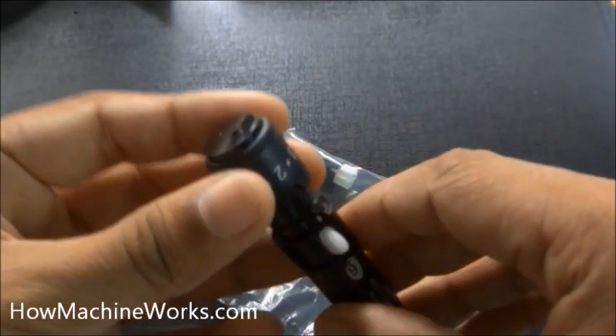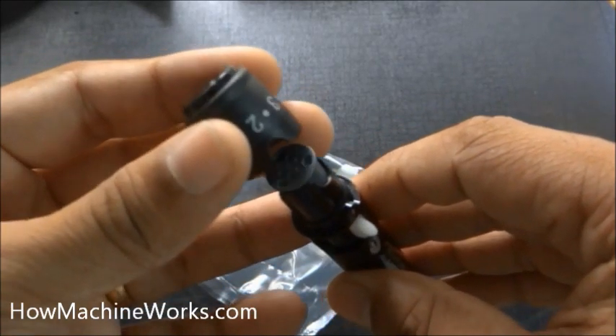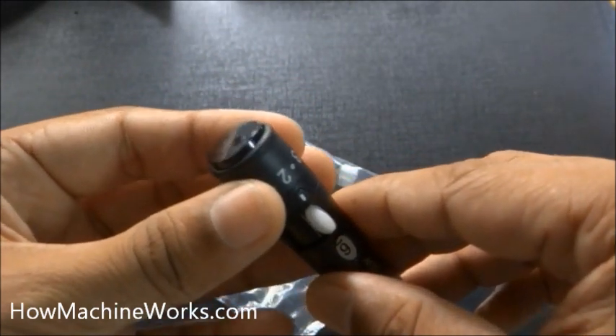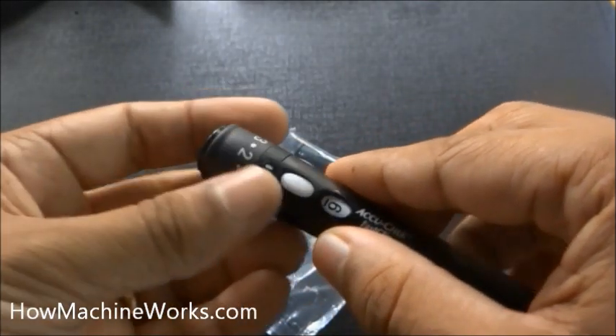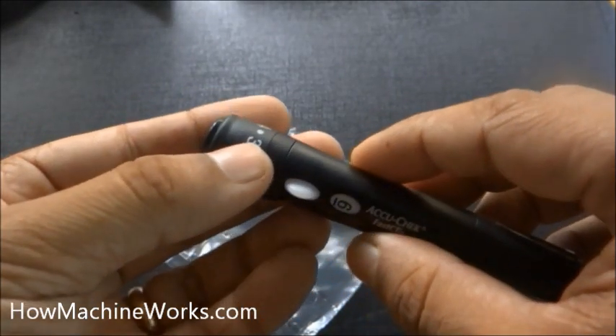That's the hole through which the lancet comes out. Now align the cap properly and install it back onto the finger pricker. You can also see one, two, three marked on it — that shows the depth markings. You can set the depth by rotating it. It is now set at two, which is good. Initially try at that setting; if it's not working, twist it to three.